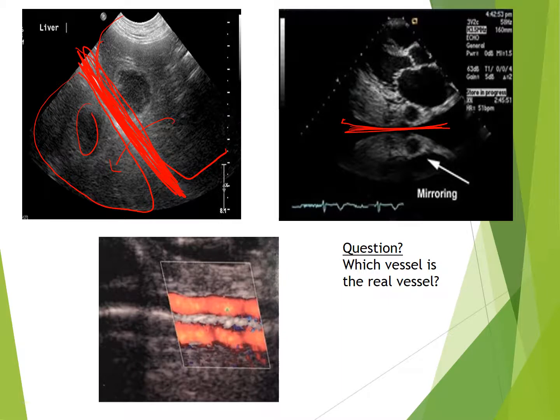So we have our strong reflector here. You can see two aortas coming across. Some other tissue parenchyma is also coming across. It's an exact replica. Again, mirror image, exact replica across a strong reflector. It actually also occurs in vessels quite often, where that posterior wall is our strong reflector. It is important to remember that the true image is whatever is closest to the transducer, as the mirror image is reflected deeper into the body.